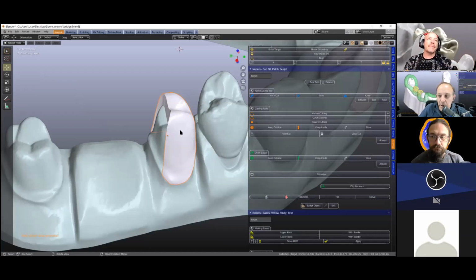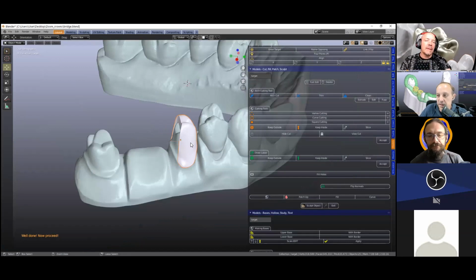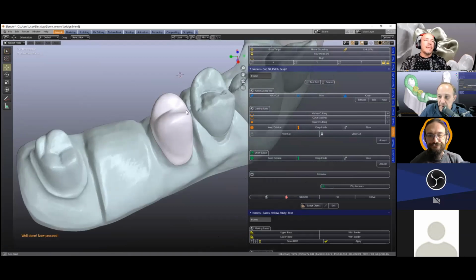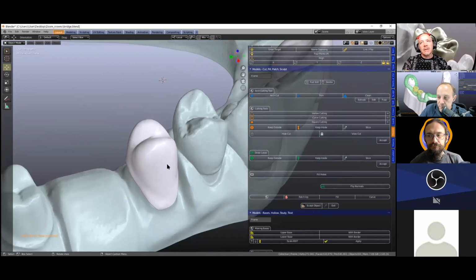Michael, is it possible to include a telescopic coping? Wolfgang, I think that would be a miniature module by itself, to be honest. Yes, we spoke about that. We probably need an implant bar and telescope small menu dedicated to those things, for telescopic work, because the bar is also milled, and we want to put attachments on the bar as well. I think that would be a milled thing. This is a side issue, because I don't want it to get too involved anyway. I think it's already quite involved as it is.